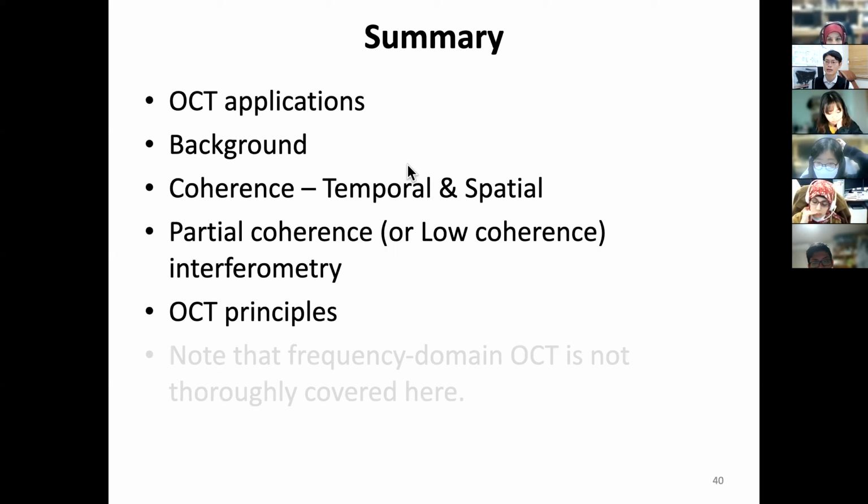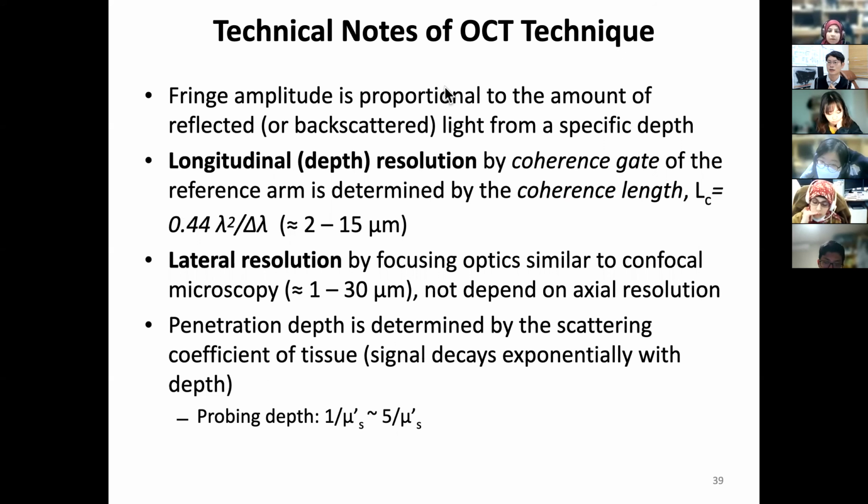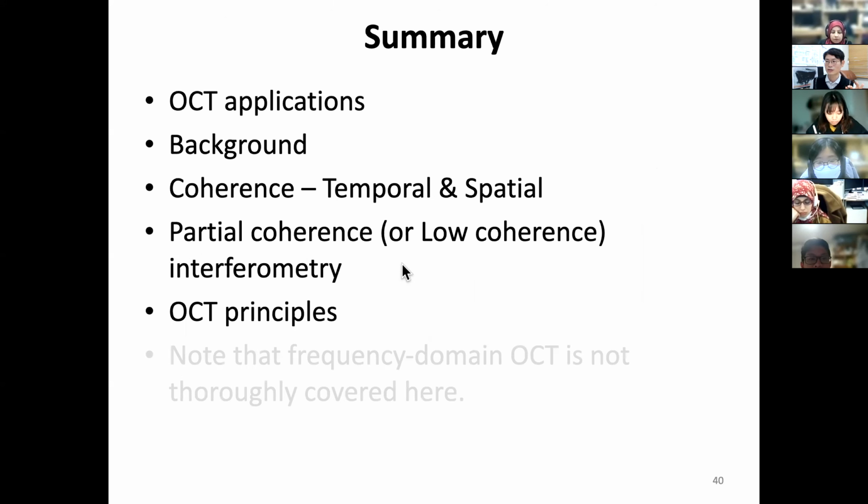I'm going to summarize OCT. The longitudinal or axial resolution is based on the coherence gate. That's just about coherence length, and you can see the definition and resolution here. In terms of lateral resolution, this depends on focusing optics, similar to confocal microscopy. And interestingly, lateral resolution is decoupled, or independent, of axial resolution, which is based only on coherence length. All right, so that's all.